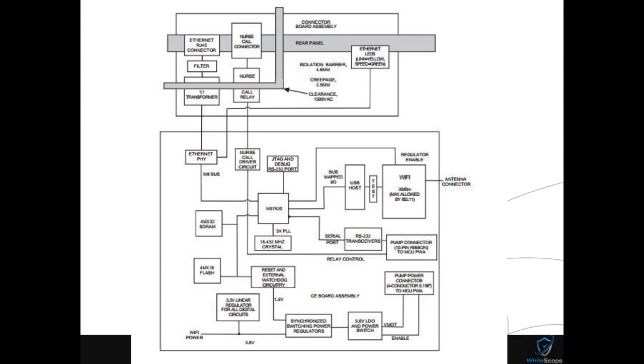I also want to talk a little bit about the architecture here. I know this slide is kind of hard to read, but there's one really important piece that's well demonstrated even if you can't read the text: there's some separation here. This top box is where most of the remote interaction comes from. When I say remote interaction, I'm not only talking about network interaction, but also patient-controlled interaction. If they're pushing a button on a switch to get more drugs, patient-controlled delivery, they do that through this top piece. Then that gets pushed to here, which does most of the real processing.